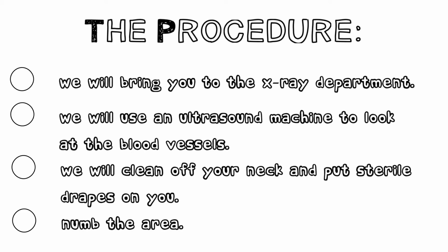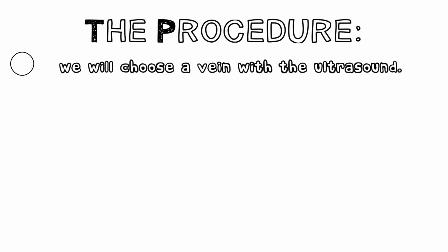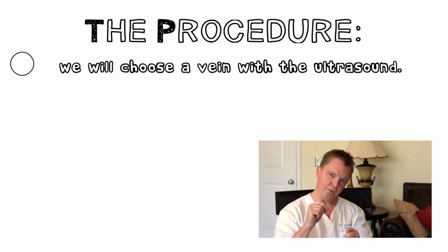Then we'll take a little tiny skinny needle and administer some numbing medicine called lidocaine. So the lidocaine is going to burn a little bit like a small bee sting, but it will numb the tissue, so the rest of the procedure will be relatively painless. After numbing your neck in the correct spot, we'll take the ultrasound machine and we'll actually watch a needle go into the vein that we choose.